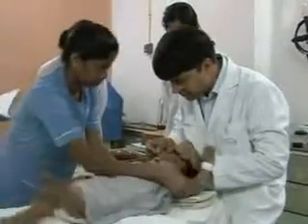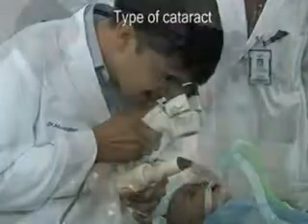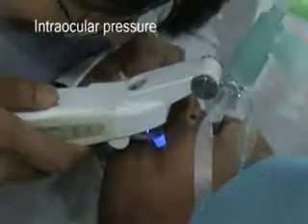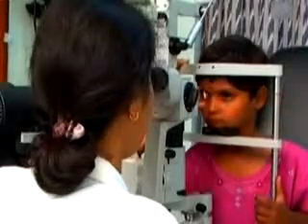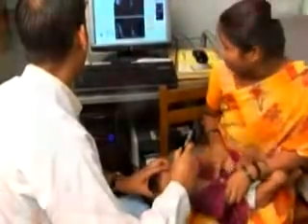Examine the child either by restraining or by using sedation or anesthesia, using a handheld slit lamp or microscope. Measure the corneal diameter and perform refraction. Measure the intraocular pressure with a handheld tonometer. You will find that older children will usually cooperate in a slit lamp examination. Perform an ultrasound B scan of the eye if you cannot visualize the fundus.